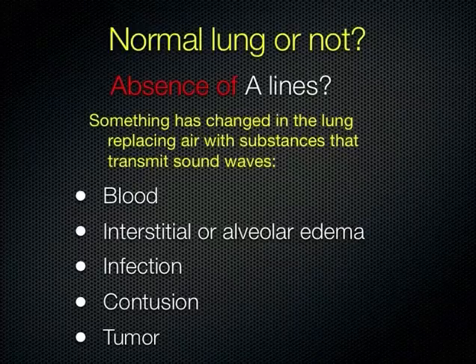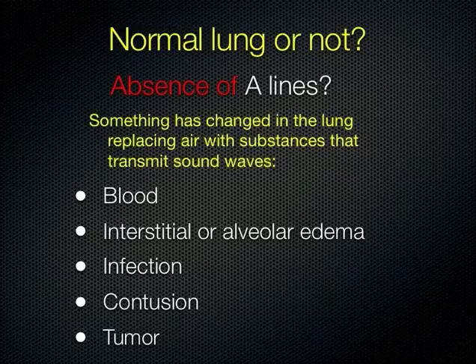It doesn't really depend on what frequency you use. You'll see this artifact because there's such a huge difference between the acoustic impedance of the pleural line and the air next to it that there will be a resonance phenomenon with most any probe you pick. Will the depth of the line change? It doesn't change. It's still the same distance. The depth from the chest wall to the VPPI is the spacing. You'll see multiples of that as it goes down.